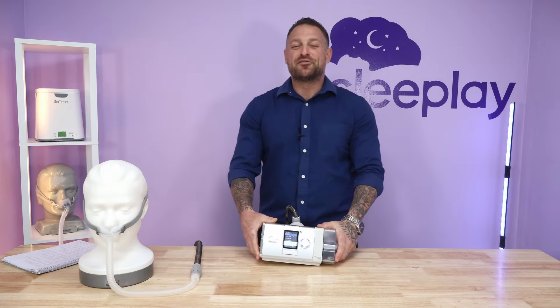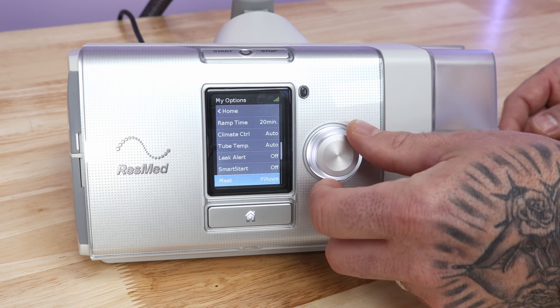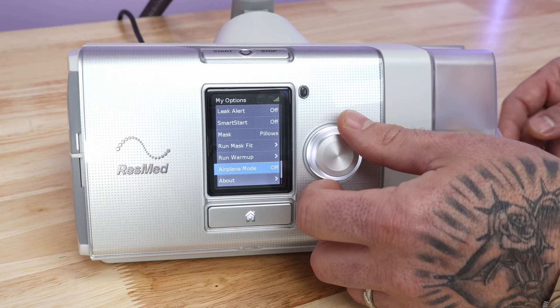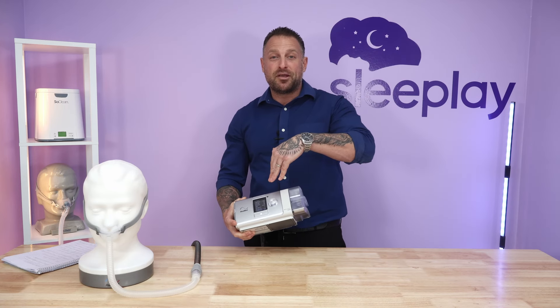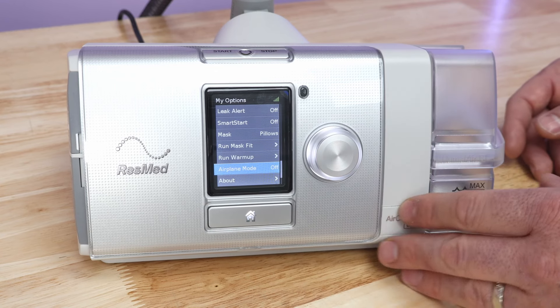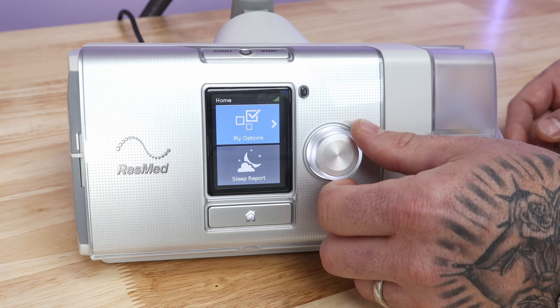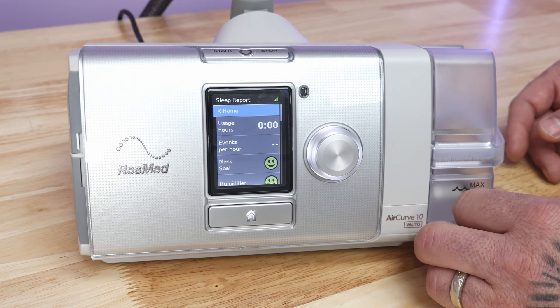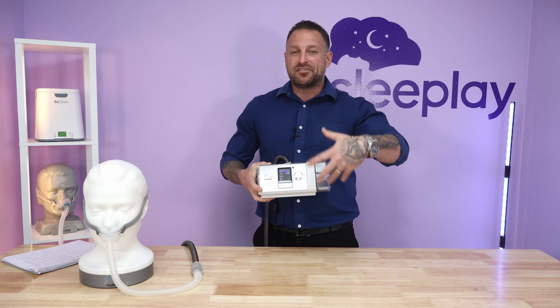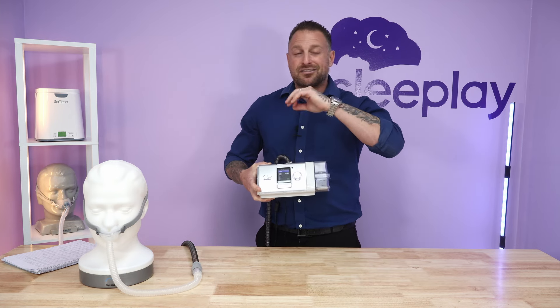On the front of the AirCurve V Auto you have ramp time, leak detection, climate control, tube temperature, smart start, mask type selection, and mask fit and warm-up options. There's also an airplane mode if you're traveling — check sleeplay.com for battery options. Below the options we have the sleep report, which pops up every time the machine shuts off. It gives you a generalized sleep report showing your mask leakage and humidifier status.